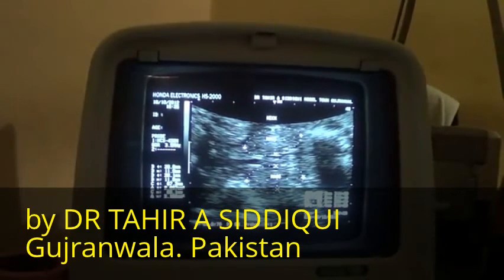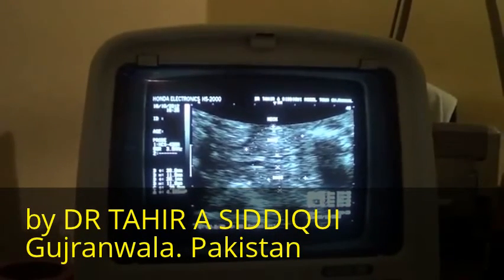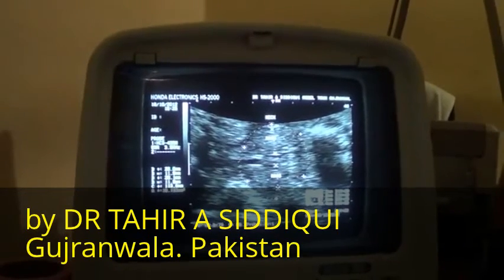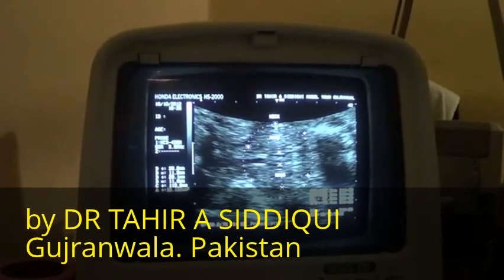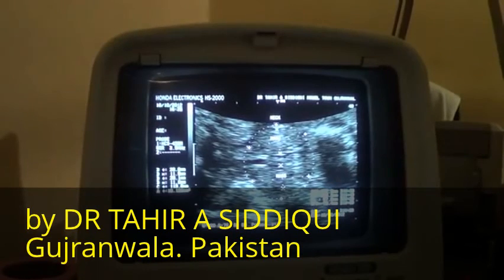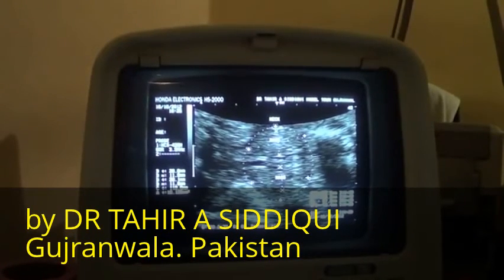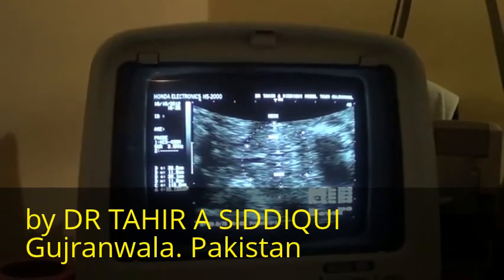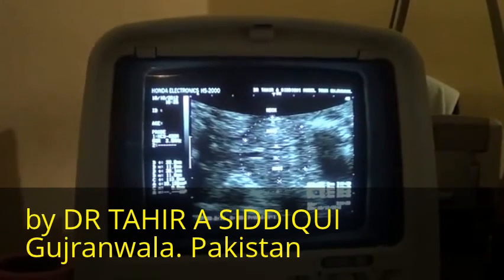So this is the main issue in this. The cause of polyhydramnios is this solid, evenly echogenic, well demarcated mass relating to the anterior neck with a vessel traversing the center, having no calcification, with no shadowing, no cystic area within it.